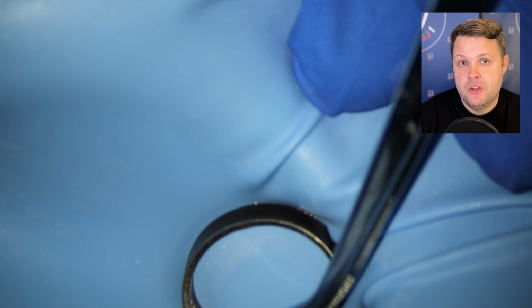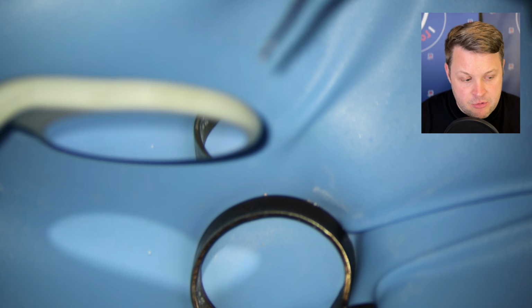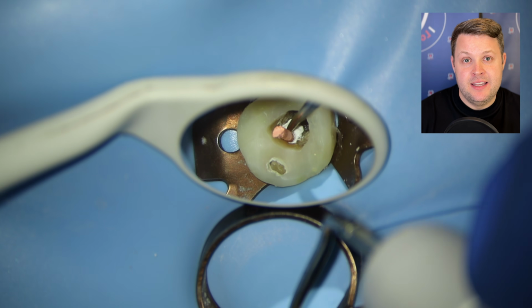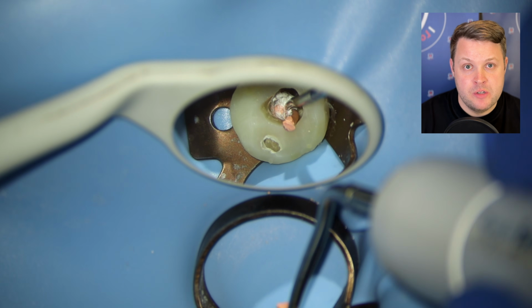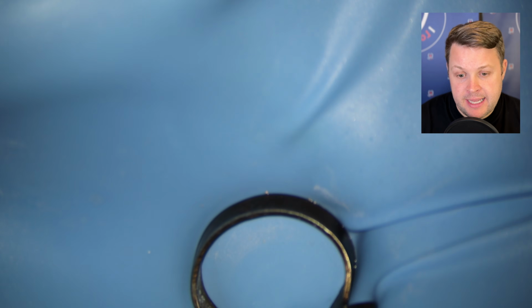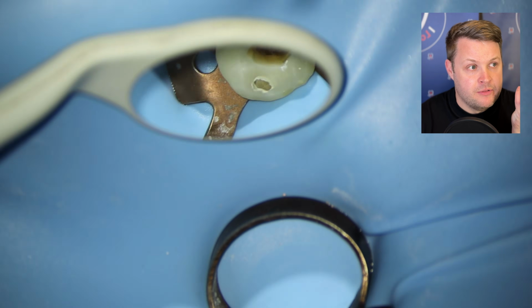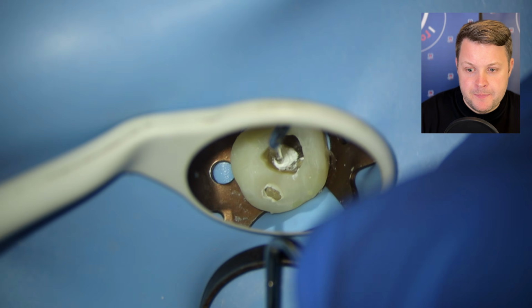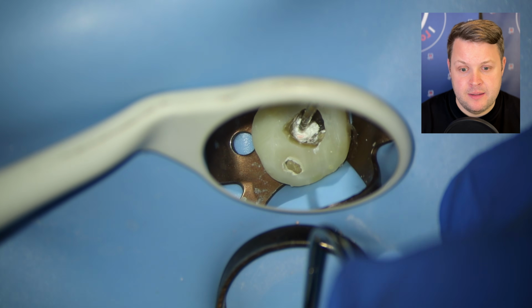More often than not, if you don't get patency with a certain canal and you fill it right up to the brim with bioceramic sealer, push the GP cone to length and then really compact the GP cone down, you'll notice that the high flow of the bioceramic will flow into those complicated lateral canals, those portals of exit. You'll see this beautiful fanning of the bioceramic that goes into all the little nooks and crannies. Just don't be gentle with this. Really try and push and condense that sealer down.